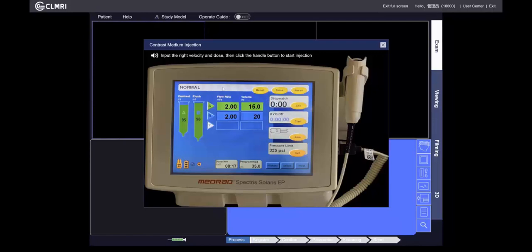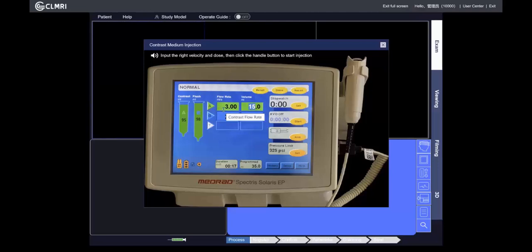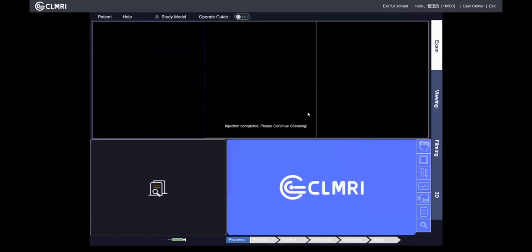The inject panel is shown in the image. You can change the flow rates or the volume. Generally, syringe A contains GD-DTPA and the second syringe contains saline. After you set the right parameters, you can click the handle button to start injection.